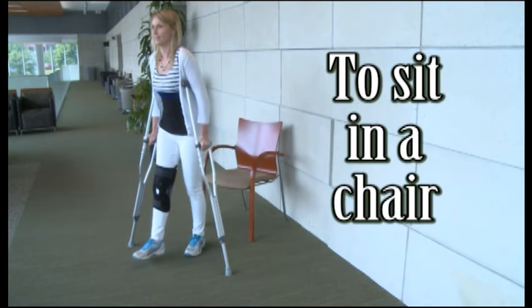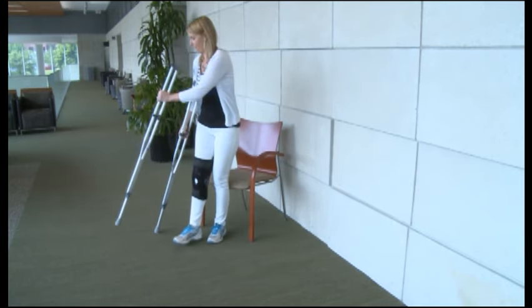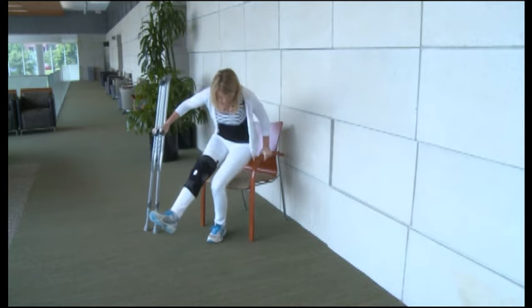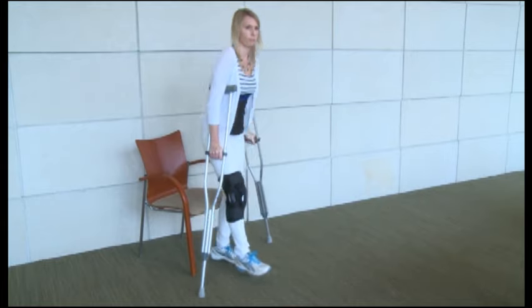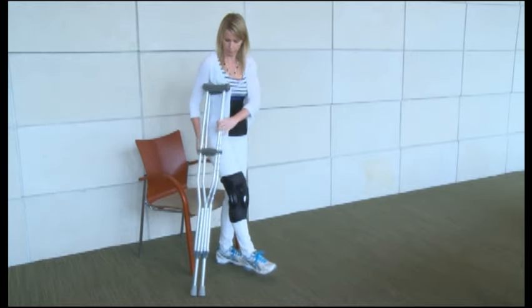To sit in a chair, back up until you feel the chair on the back of your leg. Place both crutches in the hand of your injured side, then reach back for the chair with your other hand while holding your injured leg out in front of you. Carefully lower yourself to the chair, bending at your hips and keeping the weight off your injured leg.